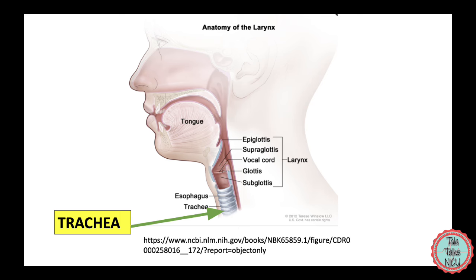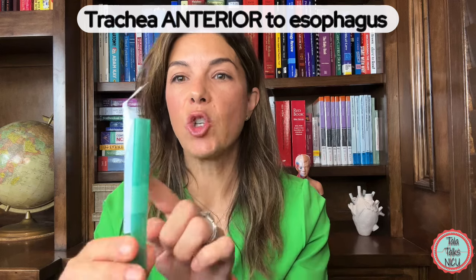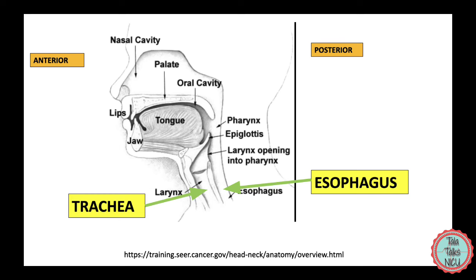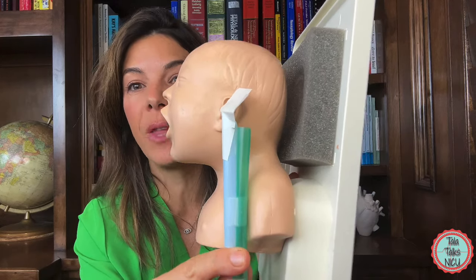There's another tube that leaves the back of the oropharynx, and that's the esophagus, which goes down into the stomach. To emphasize: the trachea is anterior to the esophagus, which means the trachea is closer to the front of the face. On an actual baby, this is what the anatomy would look like — you can see that the trachea is in front of the esophagus.